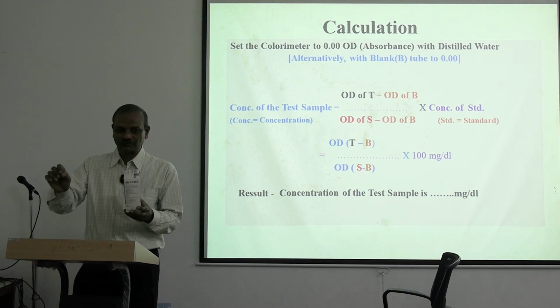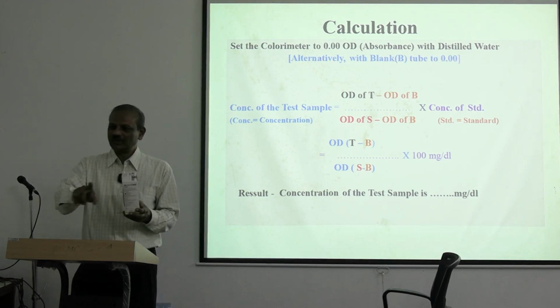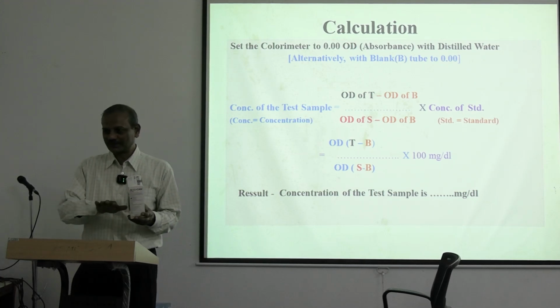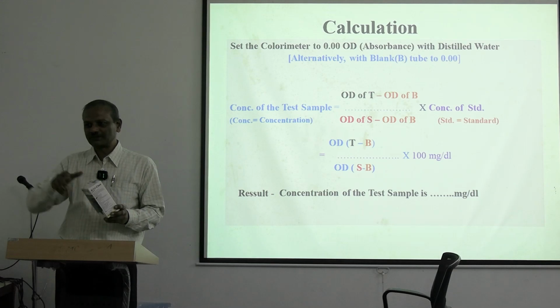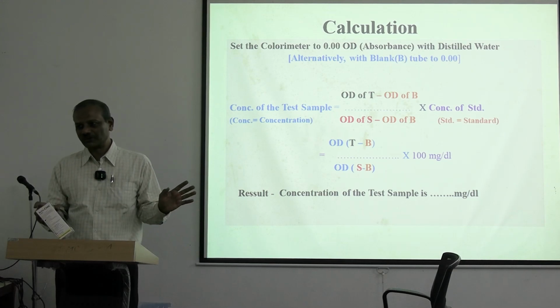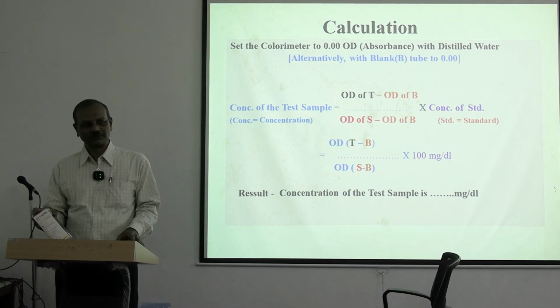For this reason I am telling you, you need to spend a considerable amount of time. There is a linear increase with the concentration of the intensity of the color. That also I want to demonstrate to you.